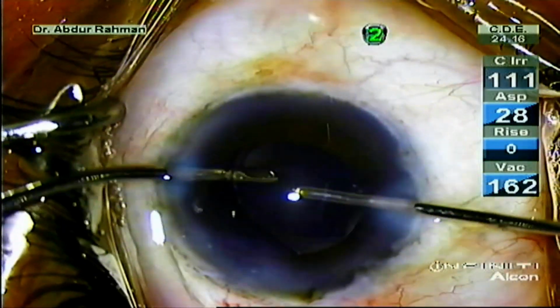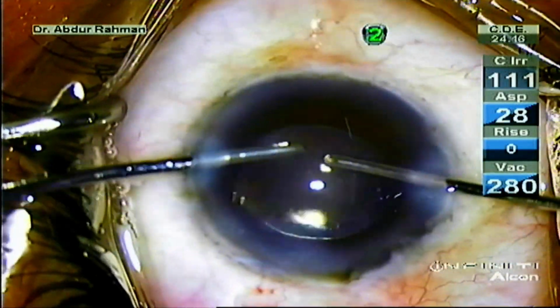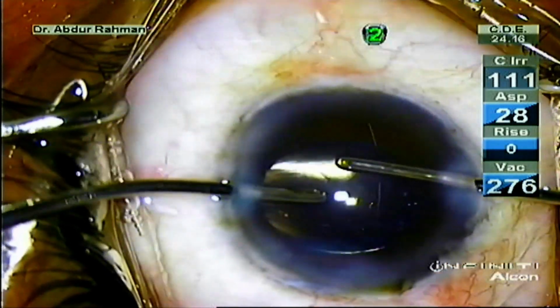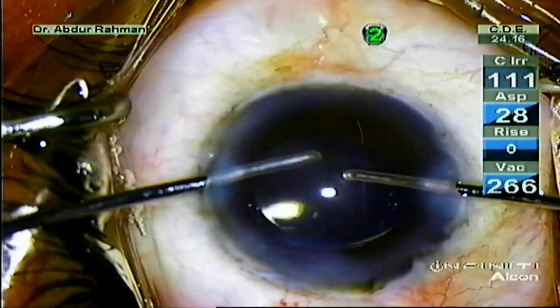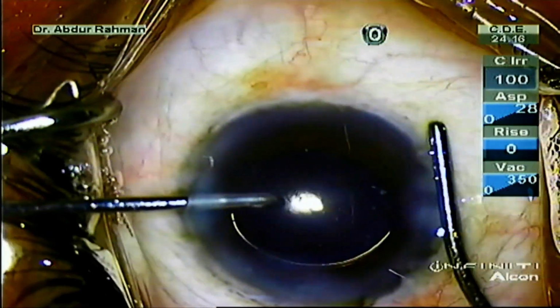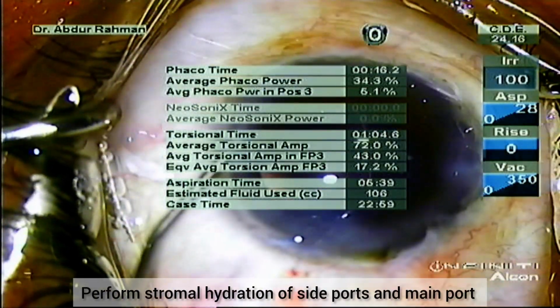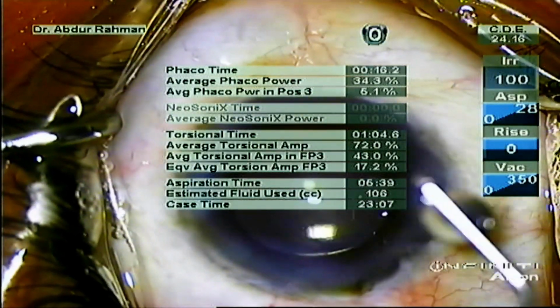Always remember to remove OVD properly, because if you leave any OVD in the anterior chamber, this will cause a postoperative IOP spike. Yes, the AC is formed beautifully. You can see my phaco CDE, how I used it in this surgery.